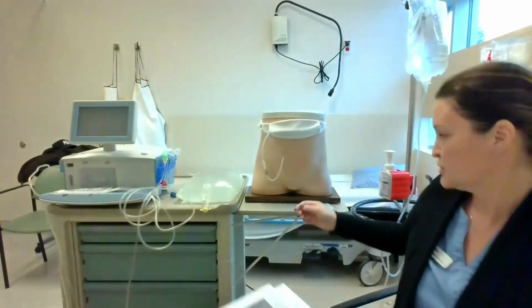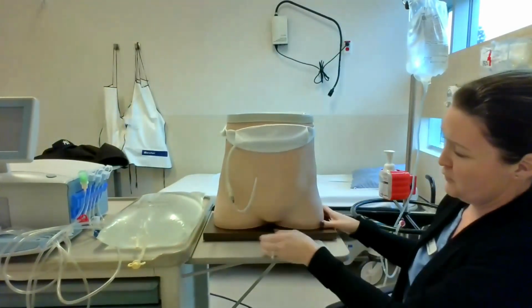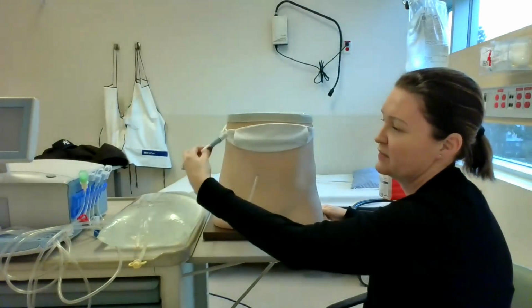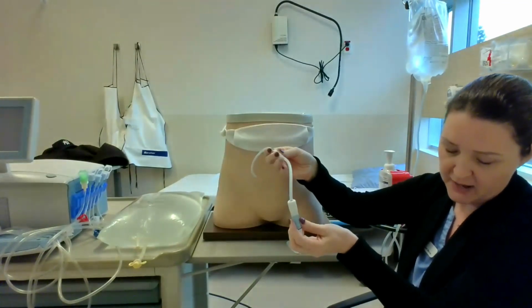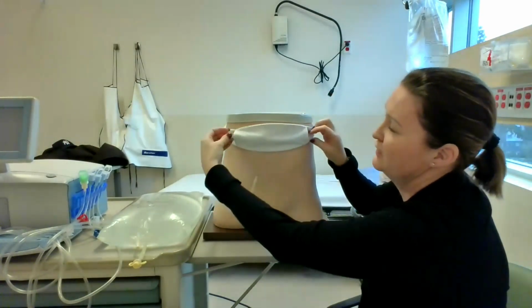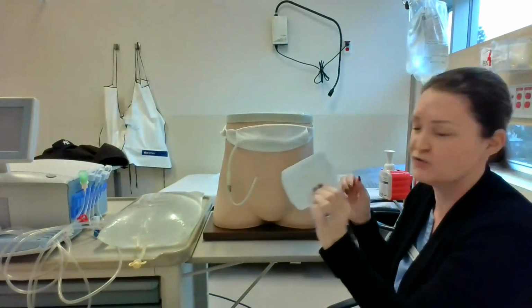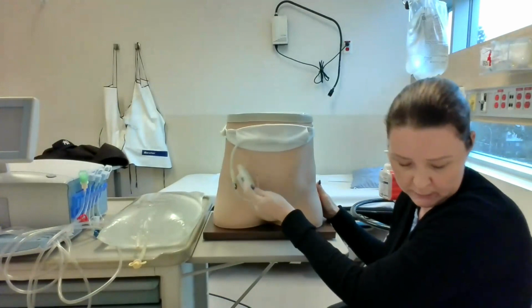What does a PD catheter look like? So I'll just show you over here. Let's move this forward. So here we have the abdomen and where the exit site is, and the PD catheter. The PD catheter is attached to the Baxter transfer set and the twist clamp. Okay, and it goes inside just our little belt that we have. And also, just to mention, you will have a dressing that goes just on top, and that is changed daily or after a shower.